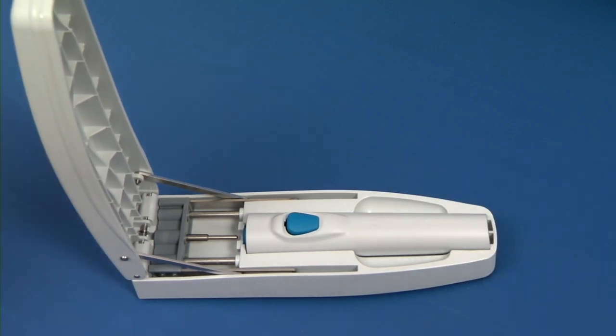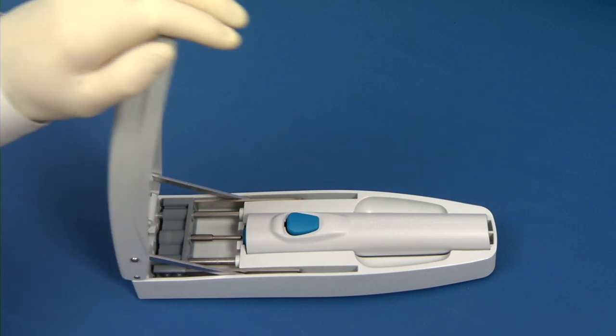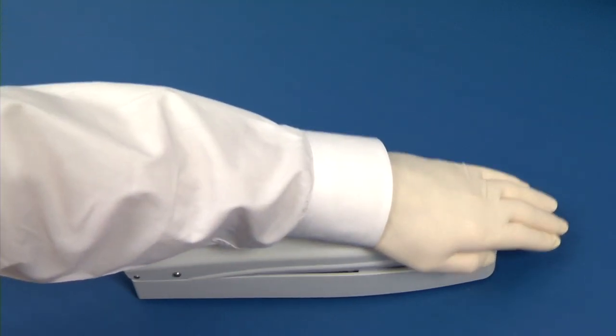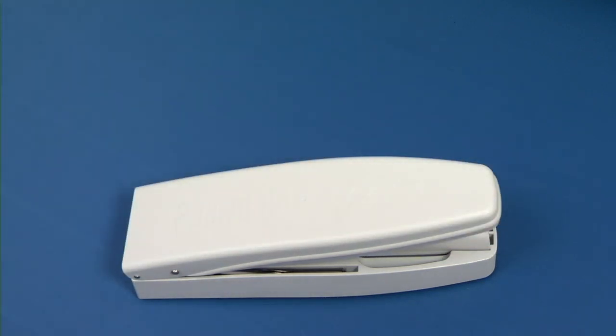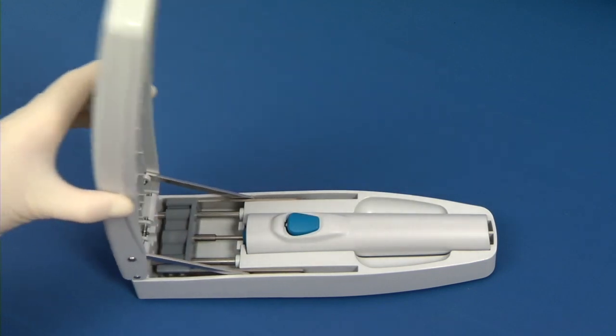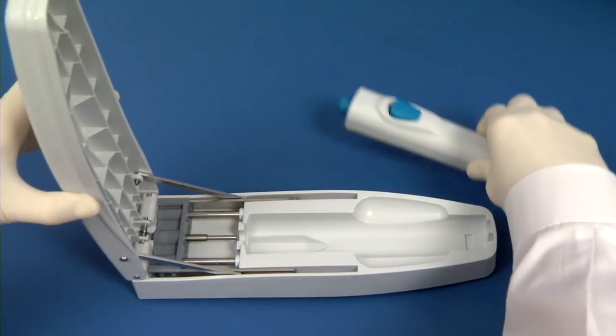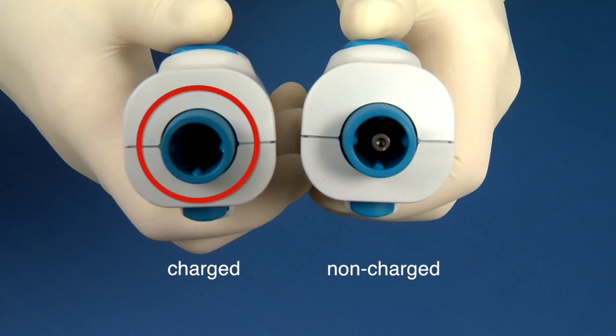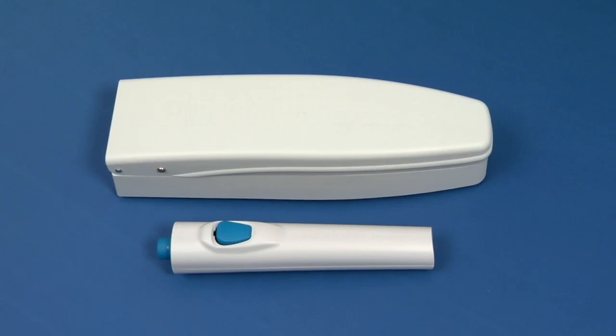Place one hand on the end of the lid and push down firmly against the resistance until the lid closes completely. The lid will then partially lift, indicating that the injector is charged and ready for use. Remove the injector from the reset station and close the lid. Check to see that the injector pin is recessed, indicating the injector is charged. The prepared injector can be placed on the counter until you load the injector in Step 3.